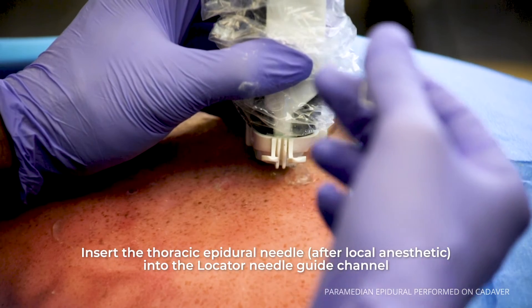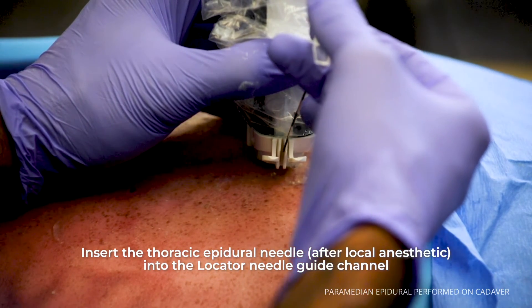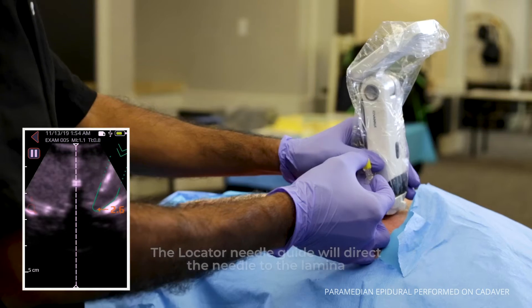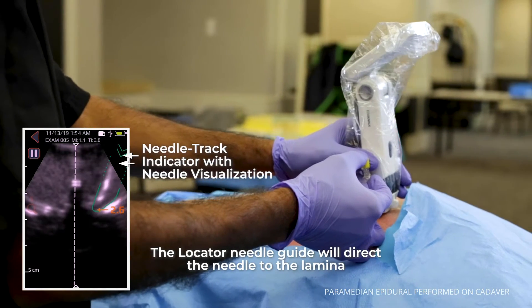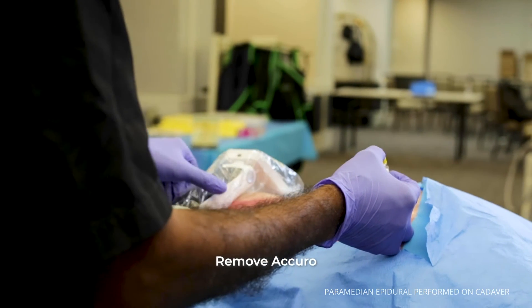At that point, you will insert the thoracic epidural after local anesthetic for skin anesthesia and to the guide. The guide will direct the needle to the lamina, at which time you can take off the Acuro.